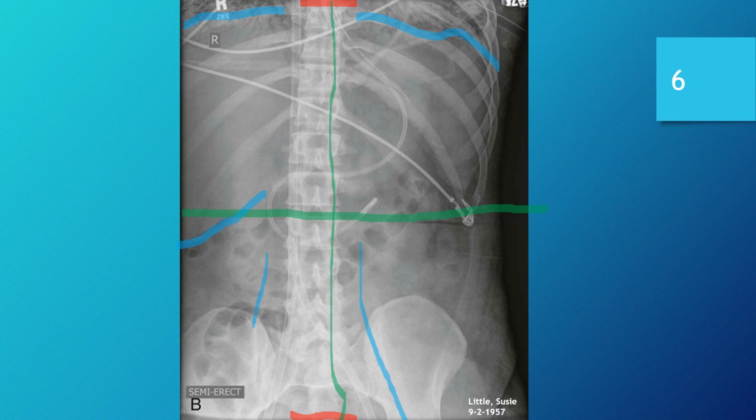Number 4, is the image free from artifacts? Well, here's where we really get to dig into things. Both external and internal artifacts are present in this exam.